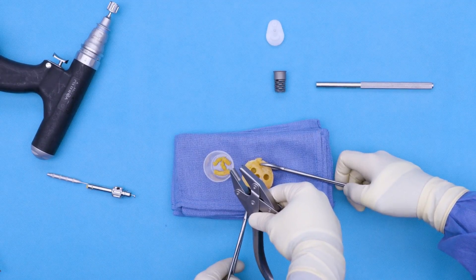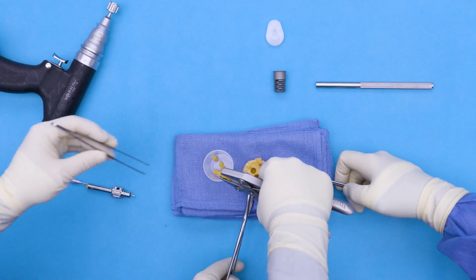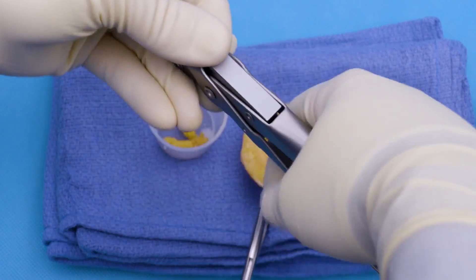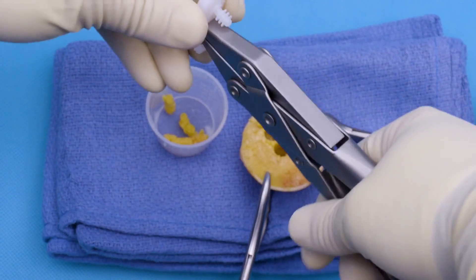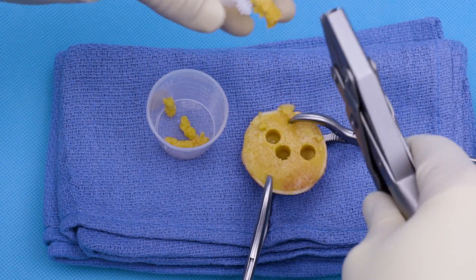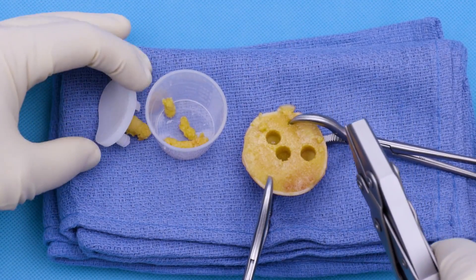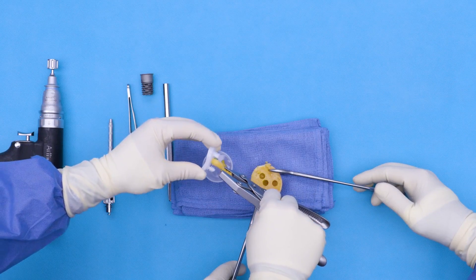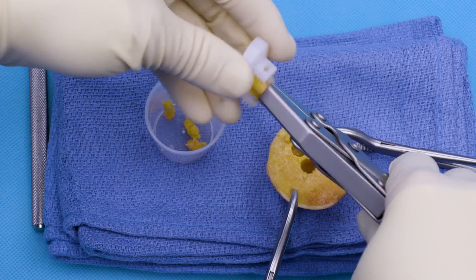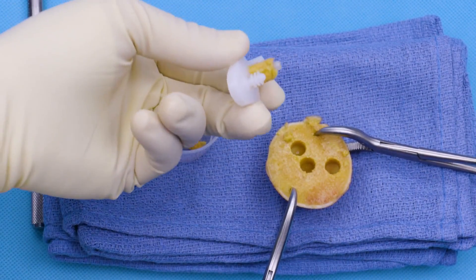Next, we're going to load our graft into our compression tool. This fits just like that. We can take our vault lock, squeeze down gently, circumferentially, just like this. We can see the bone graft here. And then I want to do this on the other side as well. We're going to complete our bone grafting by squeezing down on our other side, just like this. And then we have 360 degrees of bone graft.